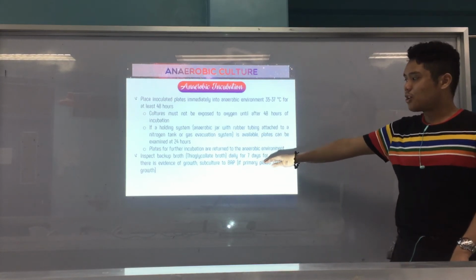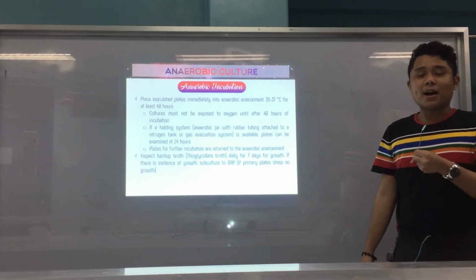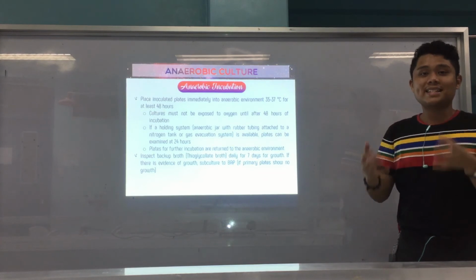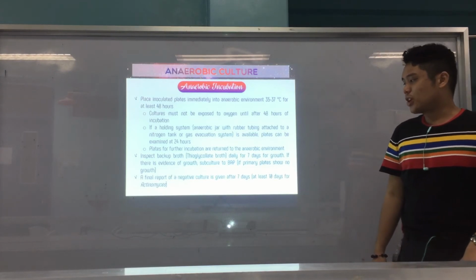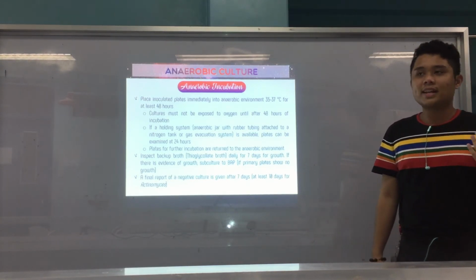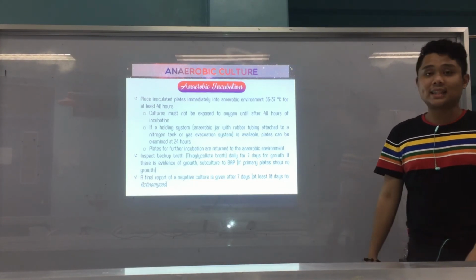Alright. And again, Thioglycolate broth is backup broth. It's also an enrichment broth para, again, if gamay pa ang pathogens sa specimen, ipadaghan, alright, para mas dali na lang siya ma-isolate. Okay. Alright. And a final report of a negative culture is given after 7 days. So same siya sa imuhang blood culture, no growth after 7 days of incubation. Pero for actinomyces, at least 10 days.